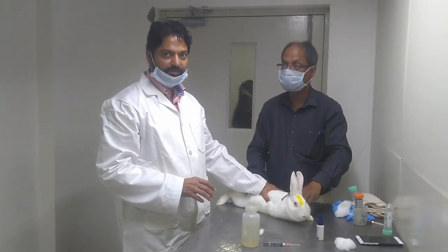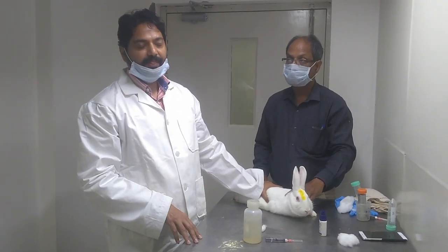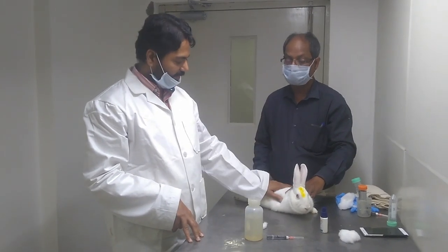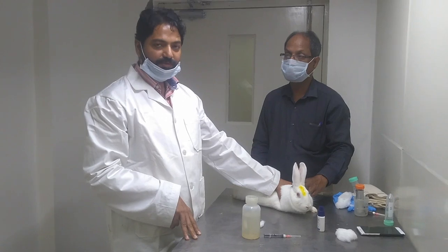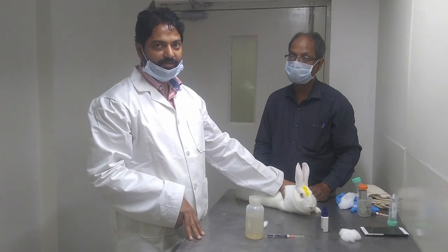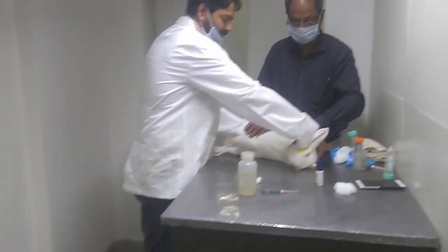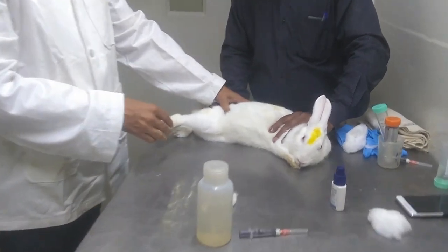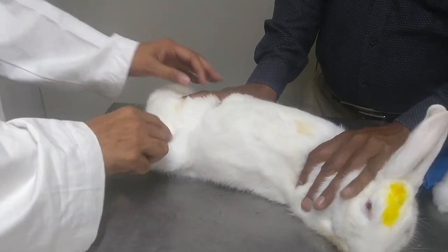Now we are preparing to immunize. The first and important thing, in all these animal processes, is that we have to avoid pain to the animal. For that purpose, we have to restrain the animal, because we have to inject. We restrain the animal in a way that it has less and less pain, and the movement is also less. We'll inject the emulsion into the thigh.